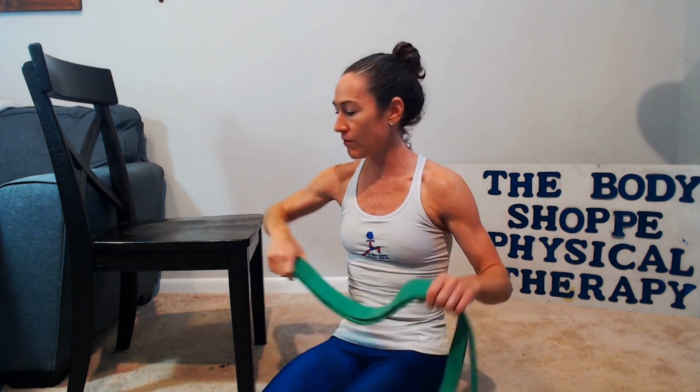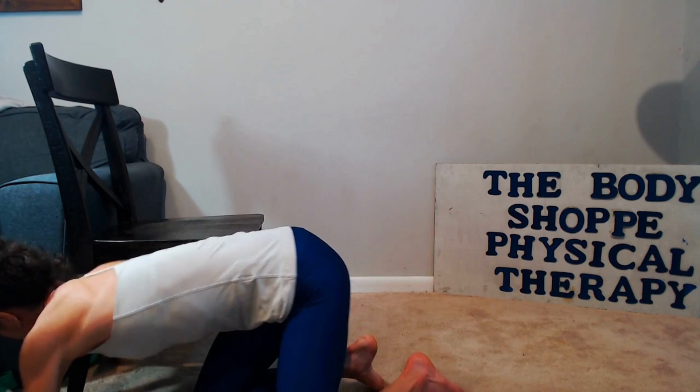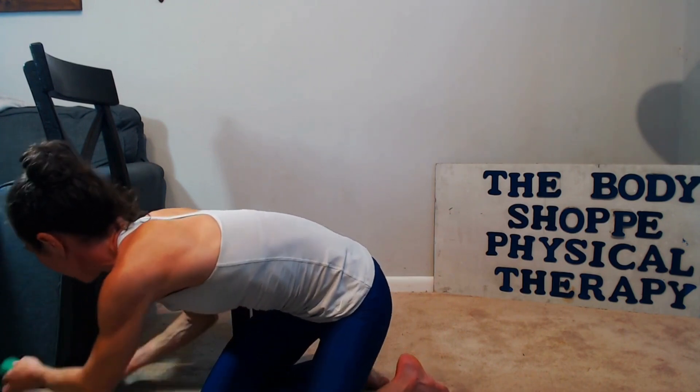I've got the edge of a couch and I'm going to wrap this band around there and thread it through so it's underneath this chair. I'm just going to use the base of my couch and a chair and wrap this right around the bottom. I've got it wrapped around the leg and I'm going to pull this through the loop — pulled through — and then it'll come right through the bottom of this chair.